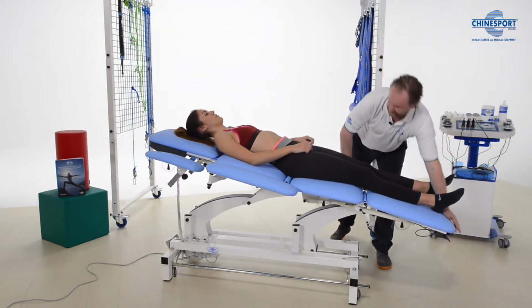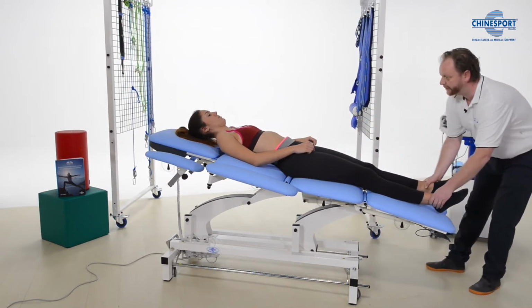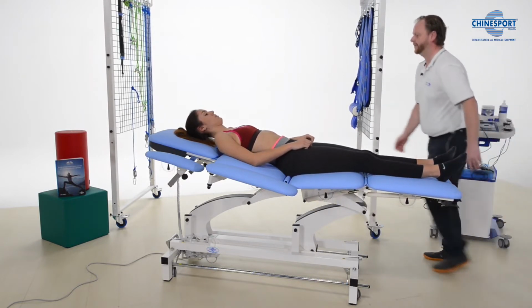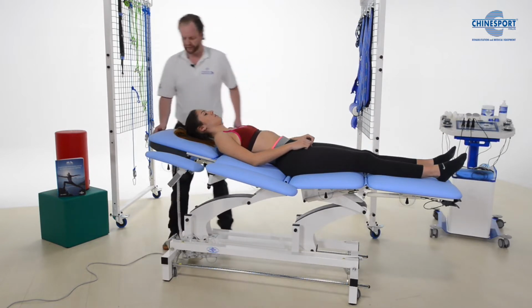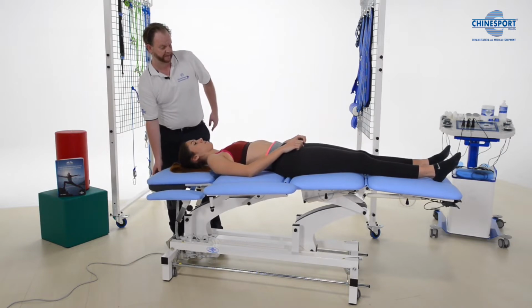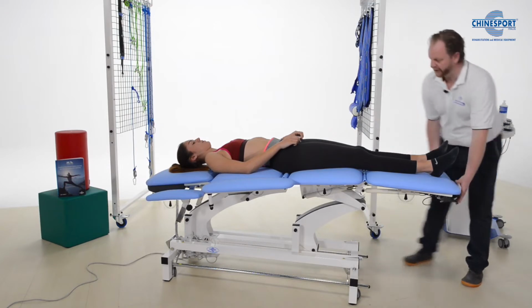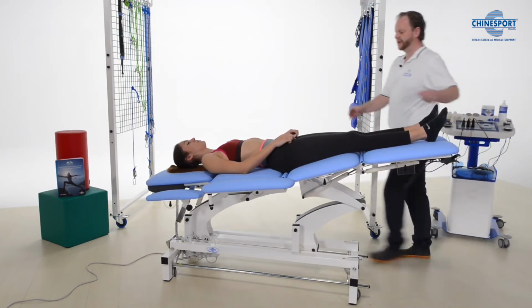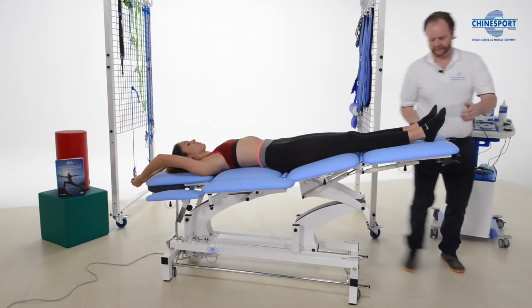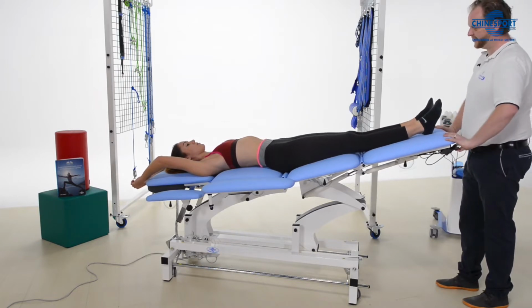to lie flat, we can provide some kind of traction here through the legs. Or if we want, we can reverse the traction and we can use the thorax and the weight of the thorax, the gravity, to then have some traction as well. And if she lifts her hands up, that will be nice, bit of traction. We can increase that a little bit.